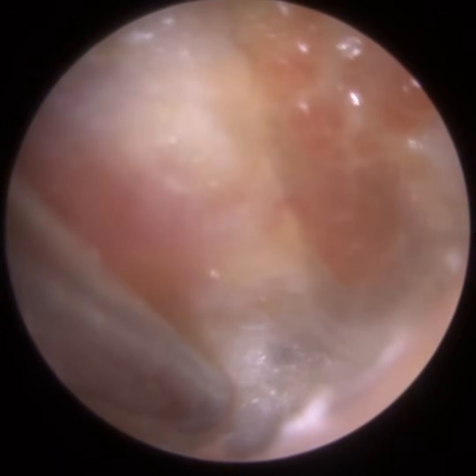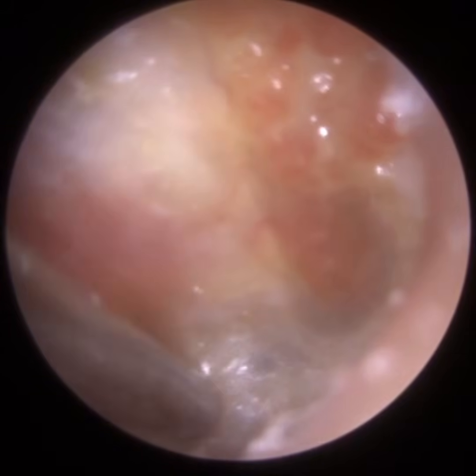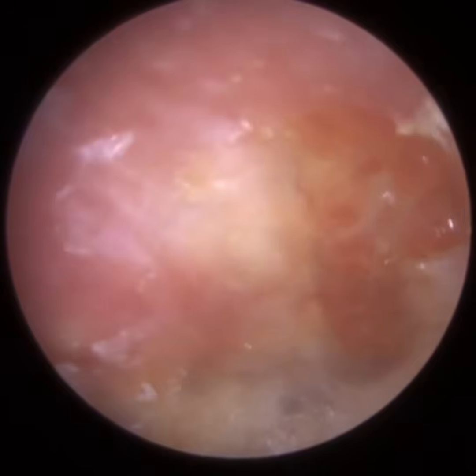Yeah, there's a bit of dampness there on the eardrum. So the patient is aware, they've got to be really, really careful to avoid water entering the ear. So I think that's the procedure done.